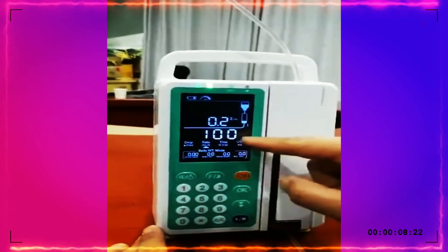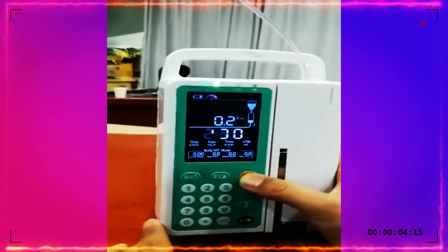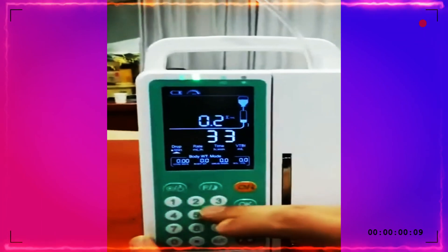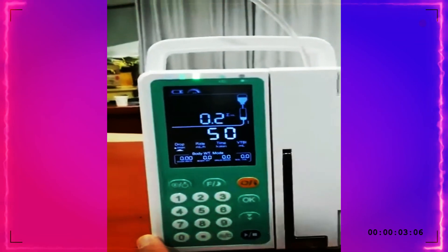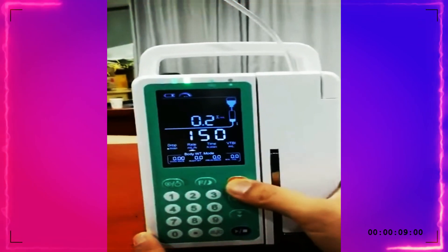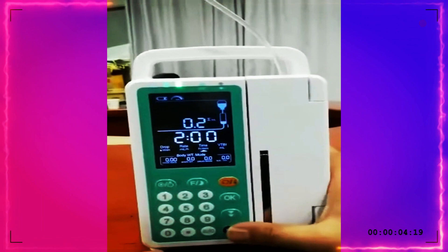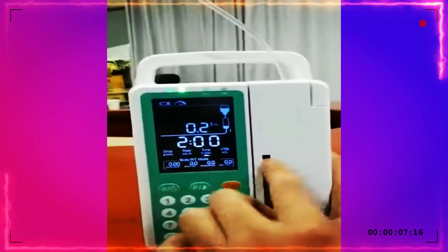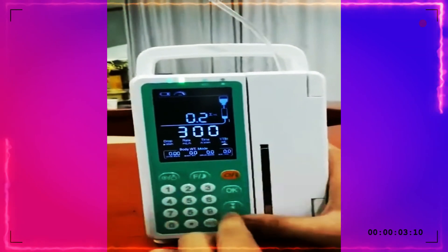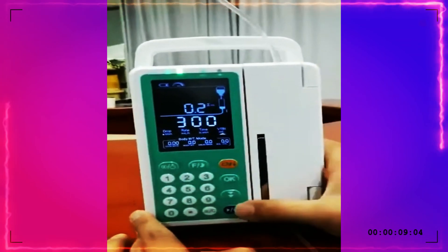This is rate and VTBI mode. For example, if we want to set the drop and VTBI mode, just press this one the same. For drop mode, we set it to 50 drops per minute. And we want the infusion time to be 2 hours — just change it to 2. Then all the parameters change automatically. Now you can see the VTBI is 300, automatically calculated. When you finish the setting, just press start.